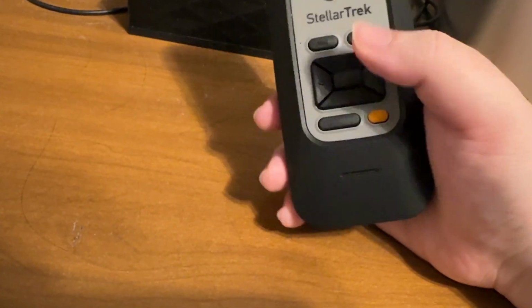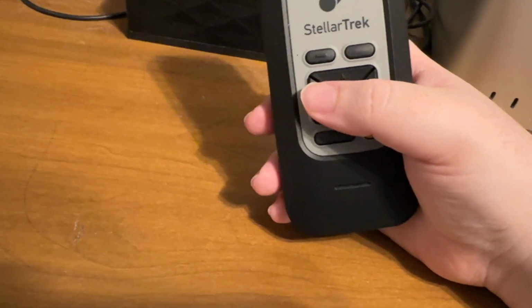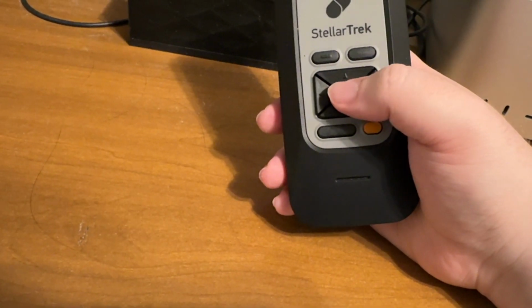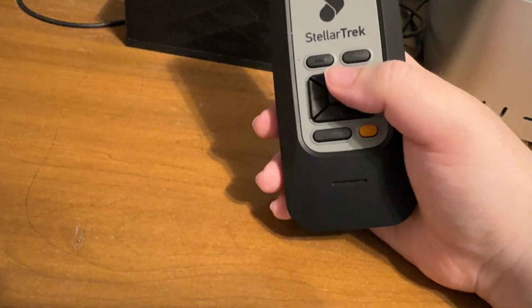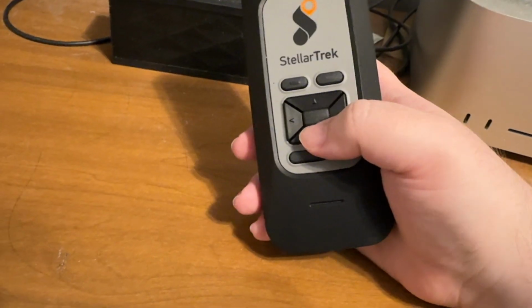So let's go back in. Select a landmark as your destination. Duncan and Quincy, St. John. I think actually we were already sorted. Home Sweet Home, Quincy. So one thing that could be helpful here, I do think I'd like to see from Humanware: press confirm to sort by creation date. When you find the sort option, to have it say what it's currently sorting by, so you know kind of where you are.